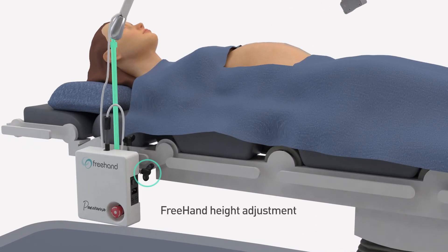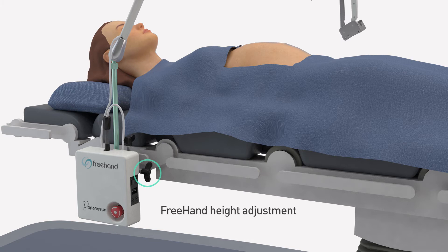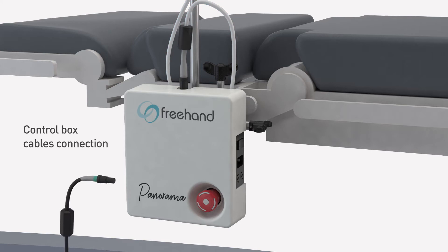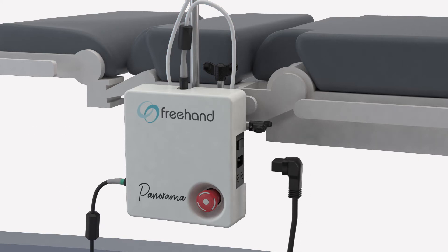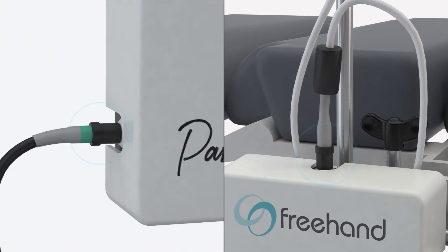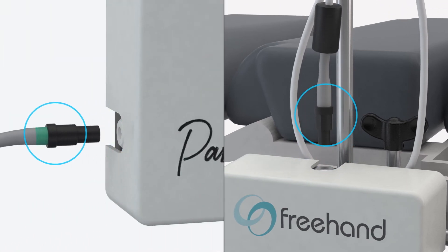The height can be adjusted using the indicator knob on the control box. Once the control box is in place, check that the RMA cable is attached and then attach and position the foot switch and power cables. Please note the correct procedure for connecting or disconnecting the RMA and foot switch cables.